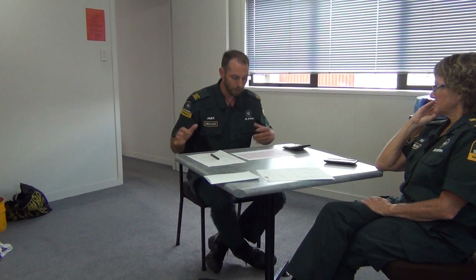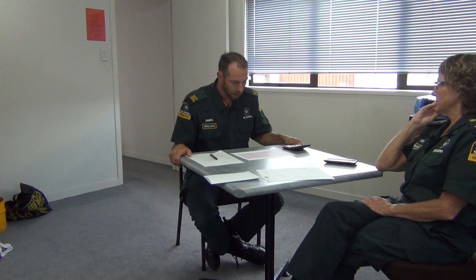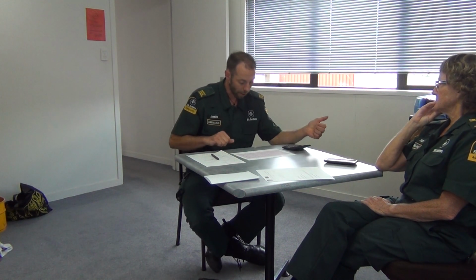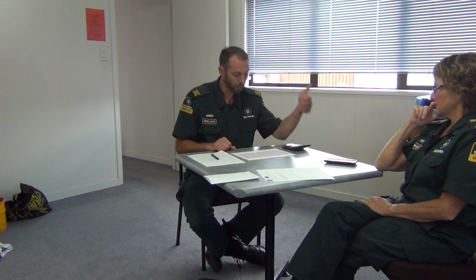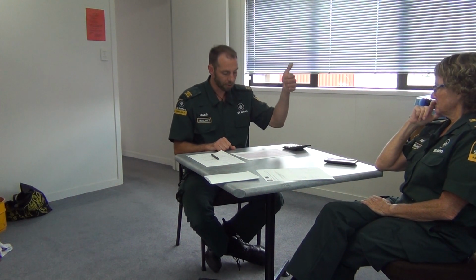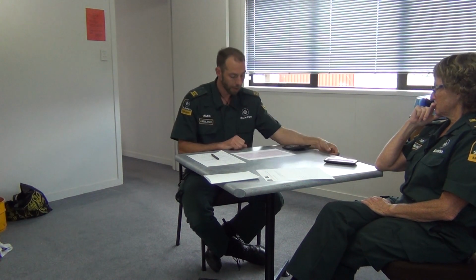So I'll come back to my interpretation. The axis, I did a cardiac axis, so I'm going to use the two thumbs. So we've got lead 1 is positive, AVF is negative, so we have a left axis deviation.